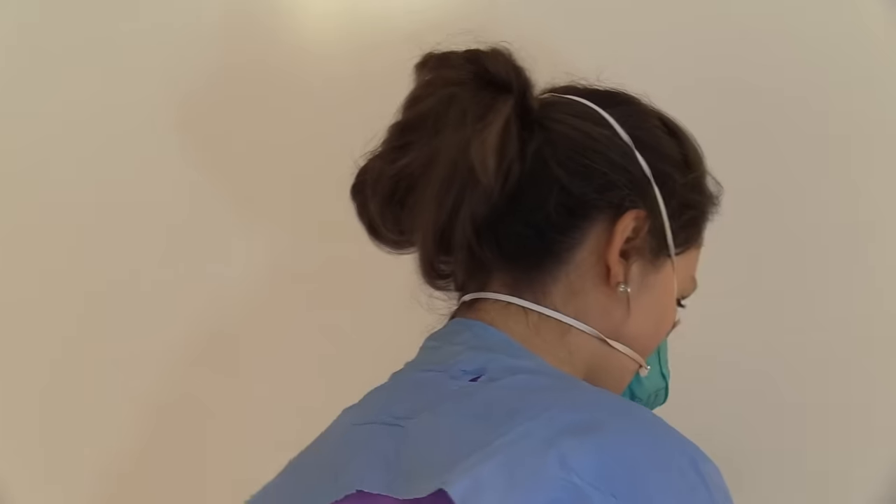To don the respirator, take the mask and place it over your nose and mouth, cupping it in your hand. Then take the nose piece and form it around your nose. Take the top strap and pull it to the top of your head, then take the bottom strap and pull it to the base of the neck. Next, perform the seal check — place your hands over the mask and gently inhale and exhale, feeling for any air leakage.